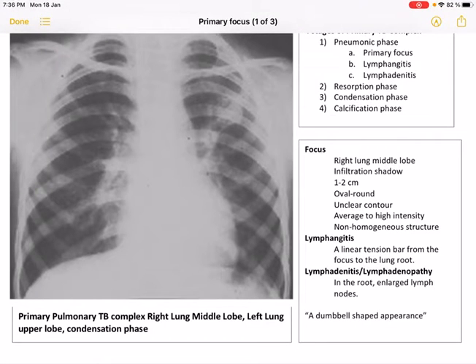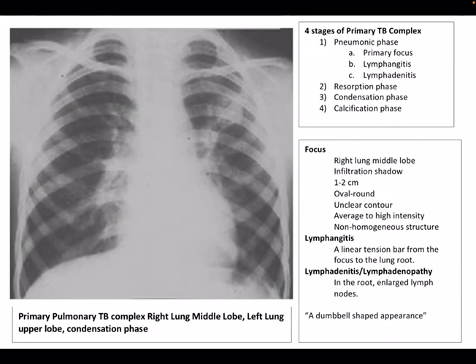Hi, my dear doctors. Today we are going to discuss the third phase of primary TB. We already discussed the first stage and second stage, and today we will discuss the third stage.